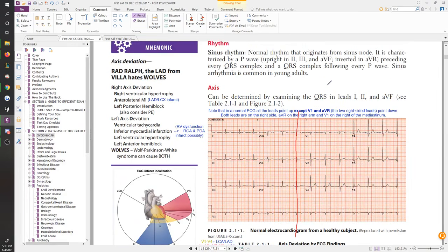Right? So if you have a general ECG, you're going to have the P wave, you're going to have your Q, R, and then S, and then a possible T. Right? So those are the things that happen. So this is your Q here. This is the R on the top, and then the S. Great, so that's your standard stuff you're looking for when you have your ECG complex.